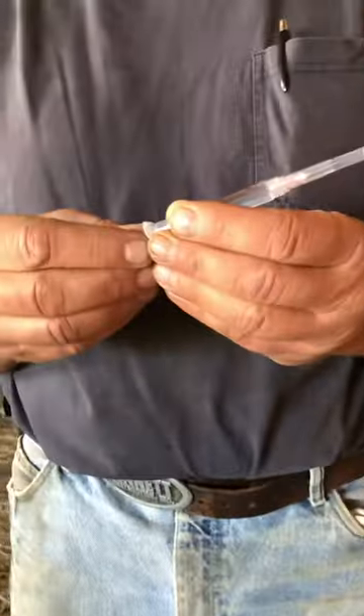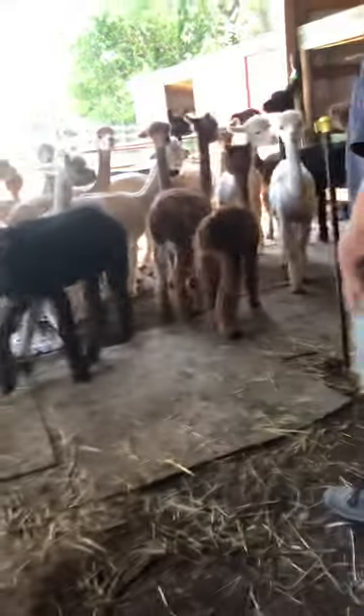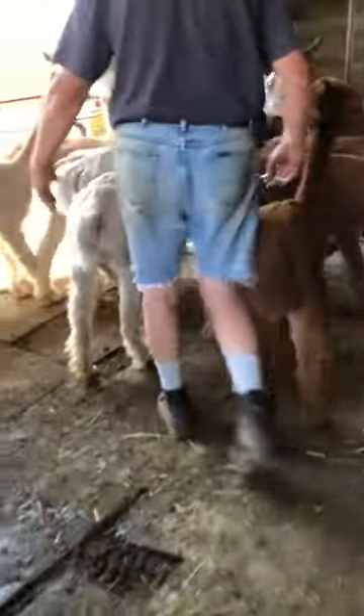I use lure lock — you can use lure slip, whatever. And we're looking for Lily. Lily is right here. Let me get her.